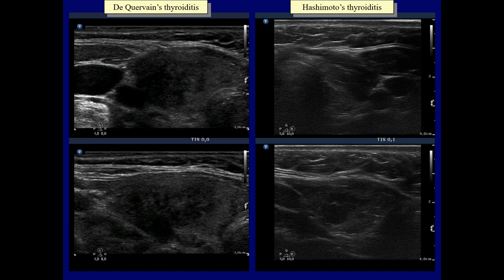The large hypoechoic field has blurred borders outside, and the small intralesional hypoechoic areas have ill-defined borders too. On the other hand, the irregular borders of the hypoechoic area in Hashimoto's thyroiditis are not blurred but sharp and puzzle-like.